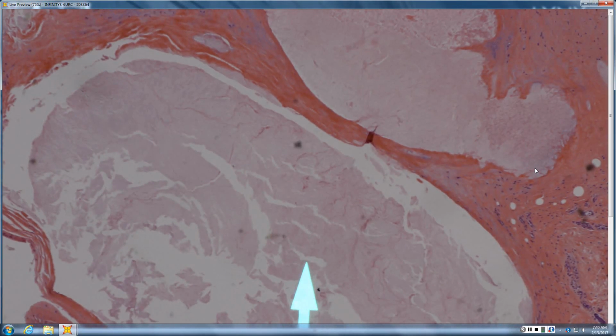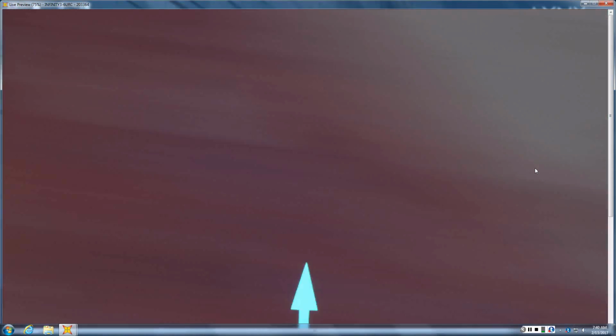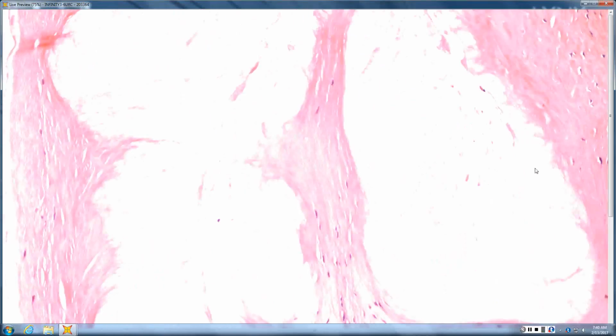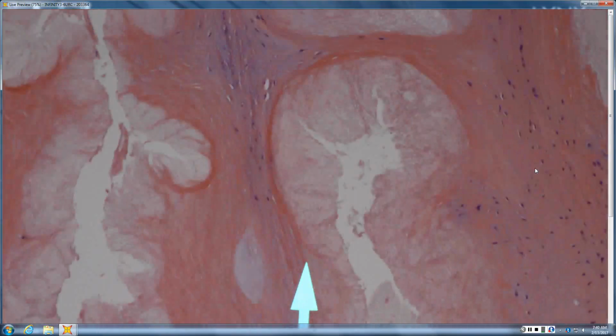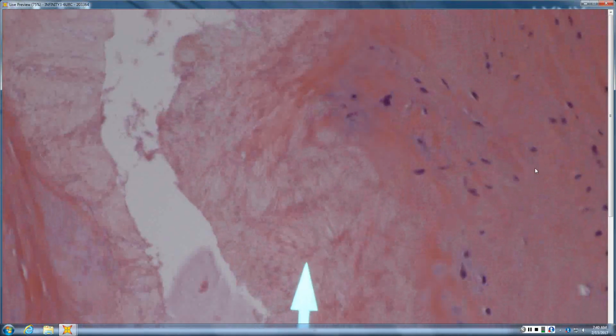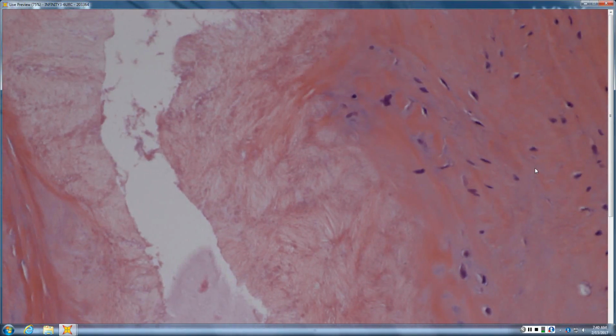So the cystic perforation in the dermis looks like it's filled with kind of amorphous, like myxoid material. So is it amorphous and myxoid or feathery crystals? Feathery crystals, so like gout maybe? Like gout, very good.